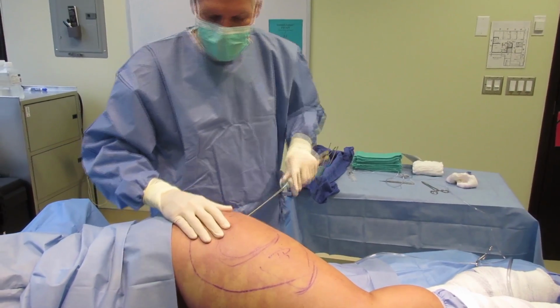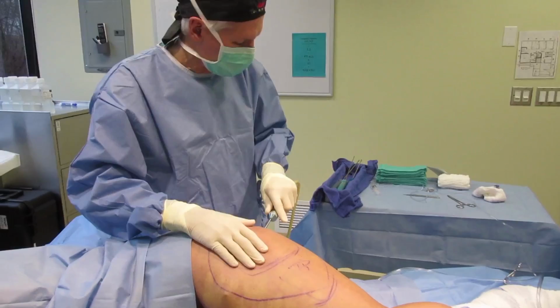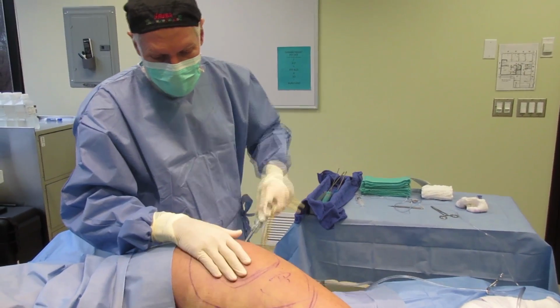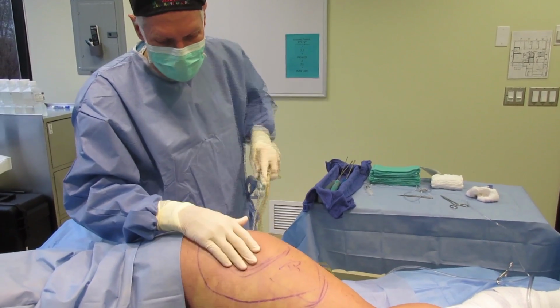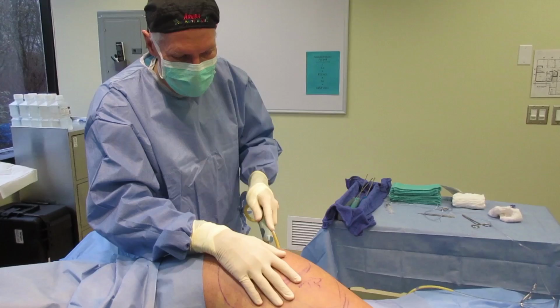Okay? And this is the beauty of tumescent anesthesia, where fat is actually coming out with little or no blood at all. So we can take quite a lot of fat out very regularly like this with little or no blood loss. And that's what's going on with this.